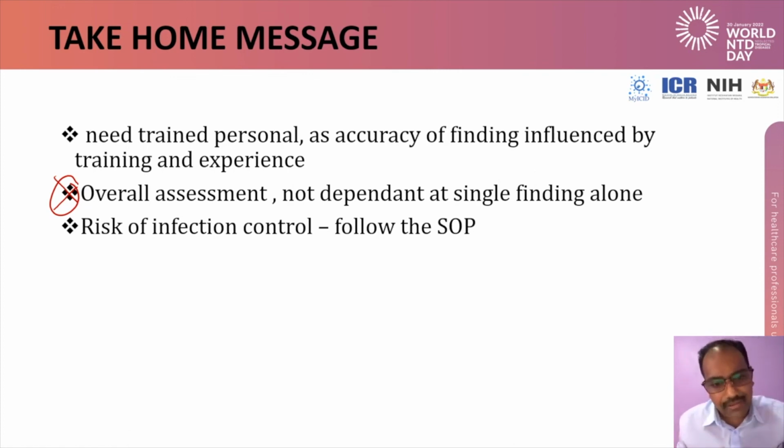So your scan is going to be an added value to support your clinical findings and to help you in fluid resuscitation. So don't take one single scan, IVC or LV, and jump into fluid resuscitation without looking at other parameters.